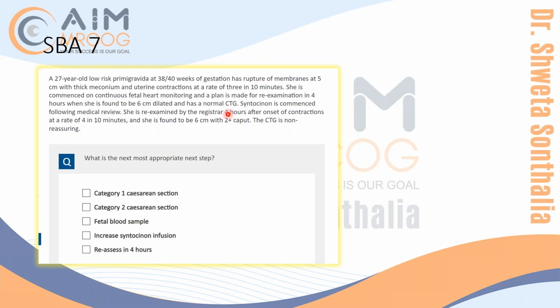Yes. If here they would have given me 2 hours of syntocinon, I would choose to increase the syntocinon infusion and make it 5 in 10.